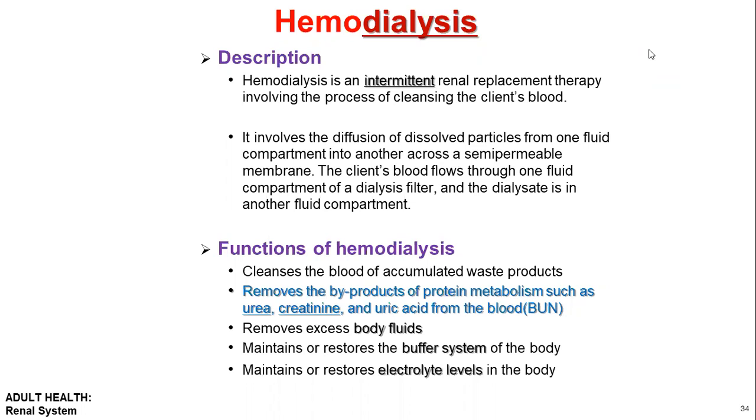If I explain it simply, hemodialysis or dialysis is the treatment that filters and purifies the blood using a machine, and this helps keep our fluid and electrolytes balanced if the kidneys do not work well, right?